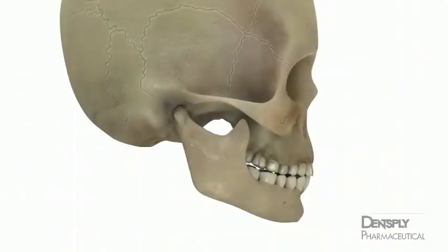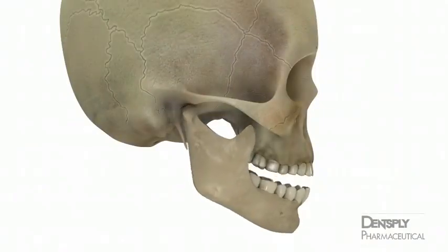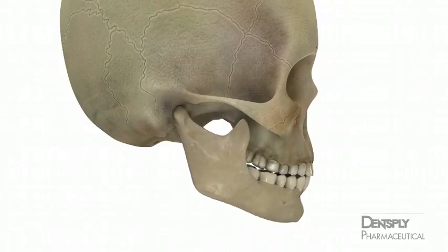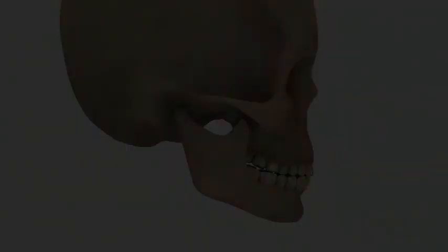A second explanation for failure to contact bone is that the patient's mouth is not open sufficiently for the neck of the condyle to rotate downward and translate forward into the plane of insertion. If the patient cannot perform this task because of trismus, then the Gow-Gates block should not be attempted. Instead, the closed mouth technique may be considered.